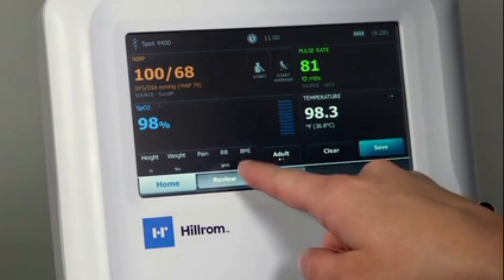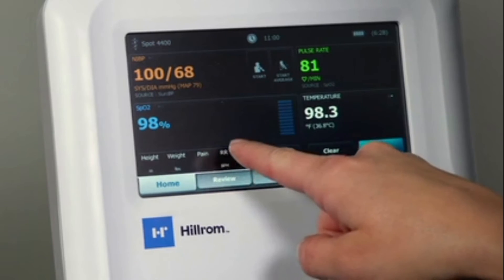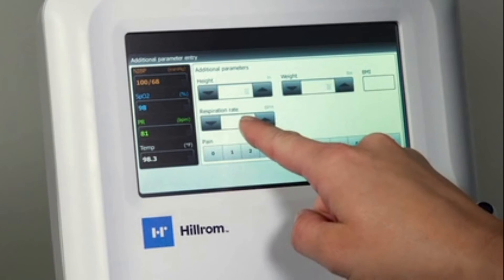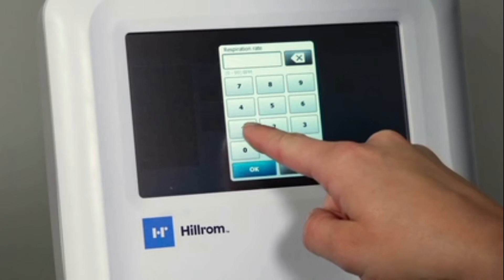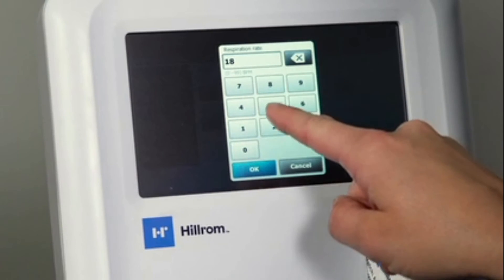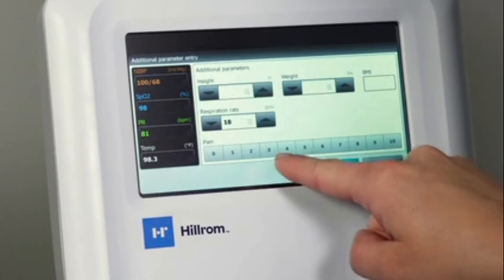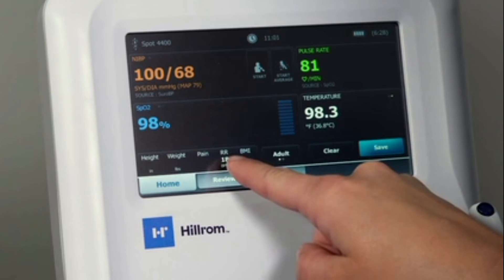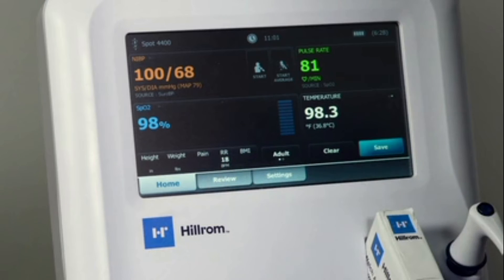You can enter additional parameters by touching and holding any vital tile on the home screen or parameter ribbon. Touch and hold any tile on this screen to manually enter data. This will cause a numeric keypad to appear for data entry. That data will then be populated on the home screen. Manual data entry is available for all vitals tiles via the additional parameter entry screen.